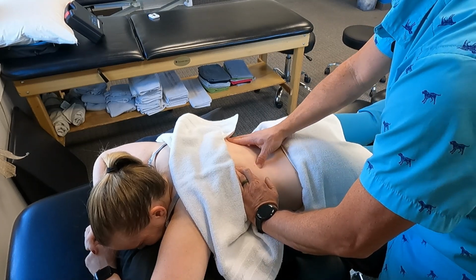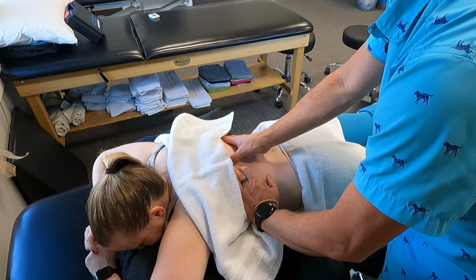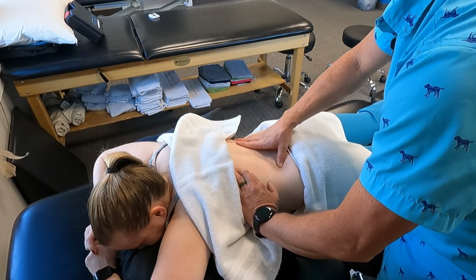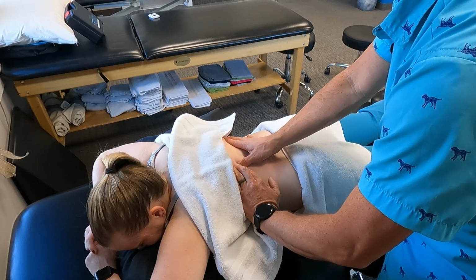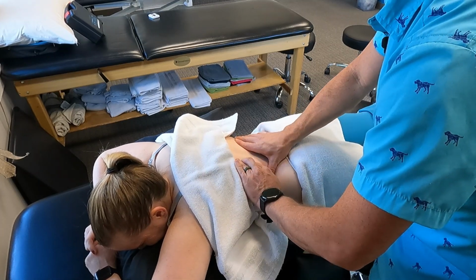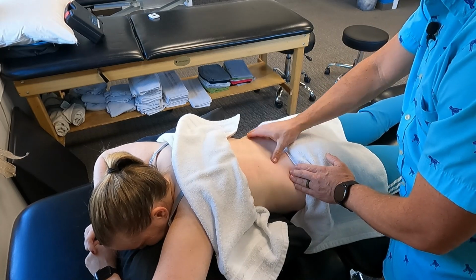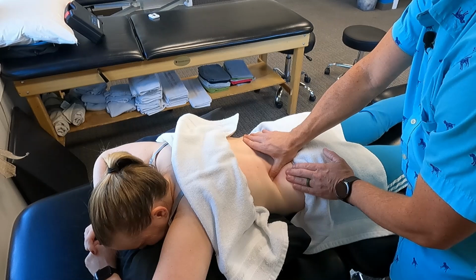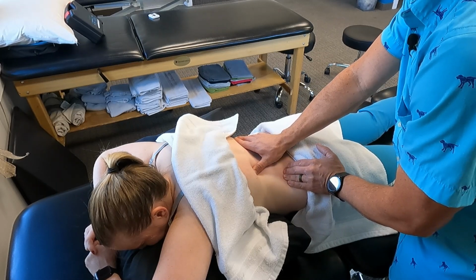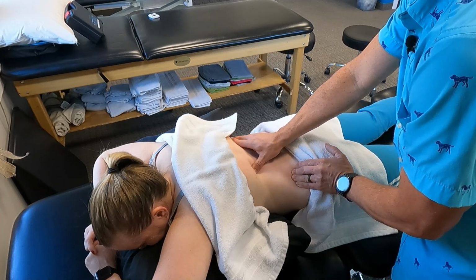So I can get a little more specific with my fingers because I can feel where that tightness is. The tools can give you a lot of feedback on what you're feeling in the tissue, but there's no substitute for your hands where you can feel what's going on in the tissue. So then I'll go a little deeper. The quadratus lumborum is a little bit more lateral, and so I'll dive kind of into that. That comes up and attaches into the ribs. So when you hit the bottom ribs, that's where that attachment is.